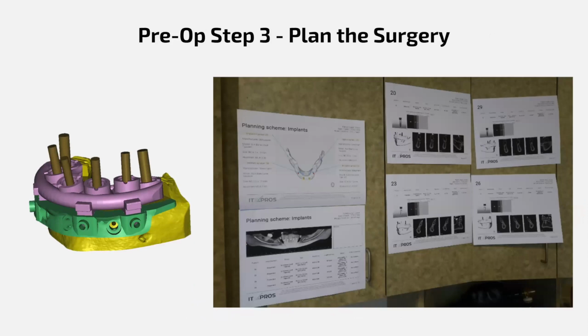Of course, in step 3, we're using CT scans and the pano or anything like that to plan the implant positions. We always recommend working with some experts to plan your surgeries. In this case, it was done by ITX pros, who always do a really great job of helping clinicians plan guided surgeries with stackable guides. And this is one of those things that you can definitely do with our workflow: pair a stackable guide with OPTISPLINT to make sure that you get a really nice fitting prosthesis and that your surgery goes very smoothly.